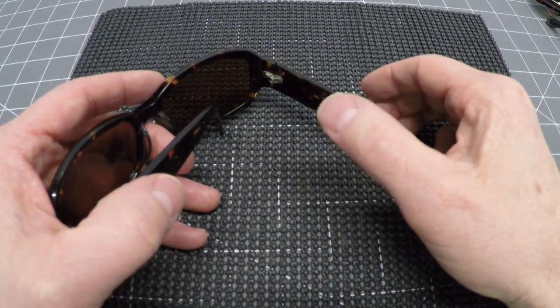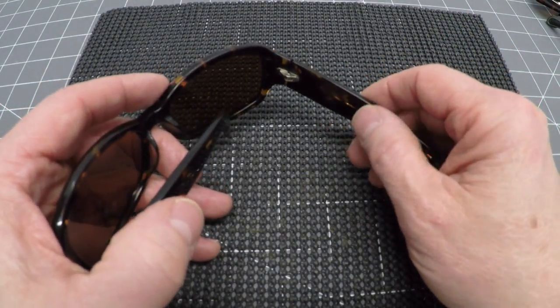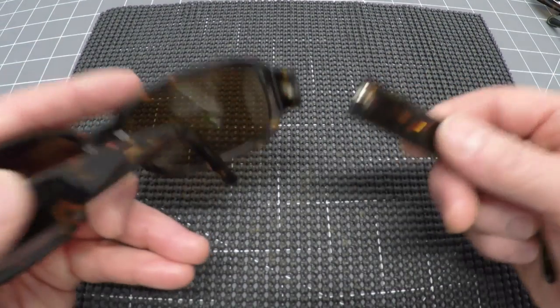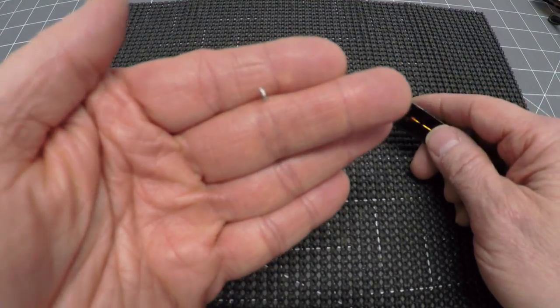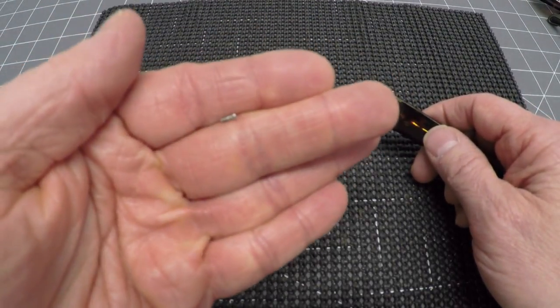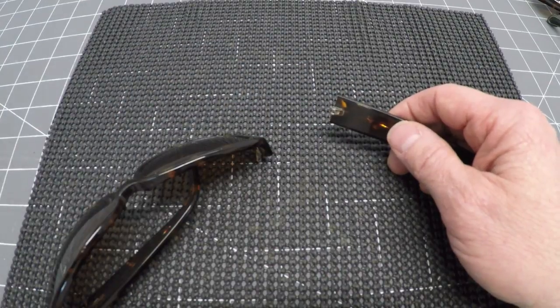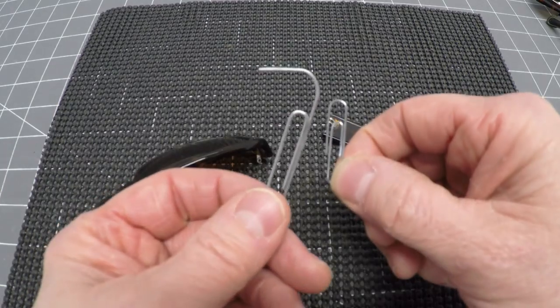Has this ever happened to you? You're on vacation, you put your sunglasses away, you take them back out, and guess what? The screw is gone. The chances of finding those are literally a needle in a haystack. Well, I've got a simple solution that works every time, and it's a tool that you probably have very close by. It's the handy dandy paperclip.